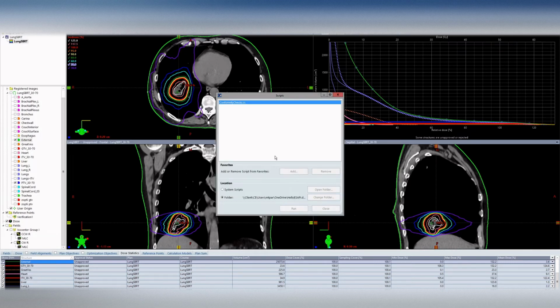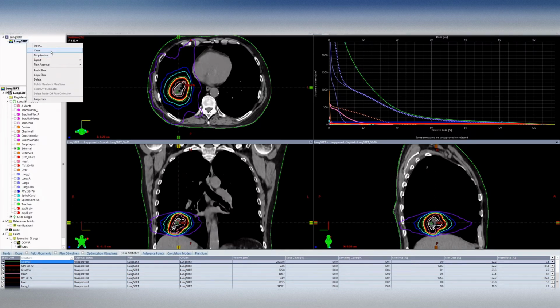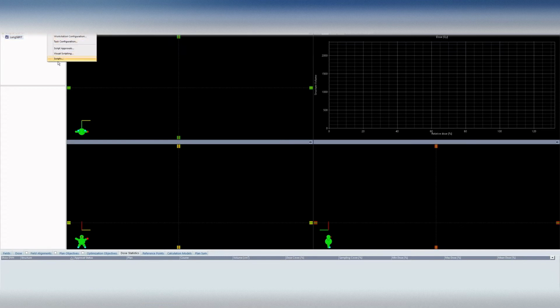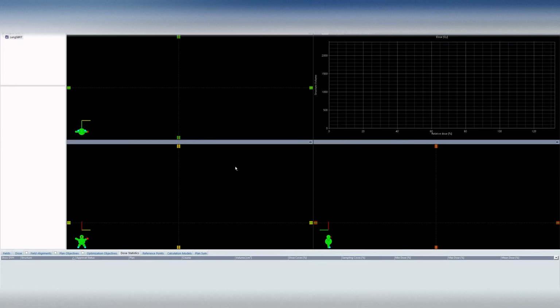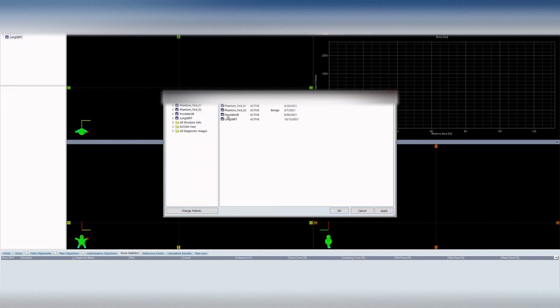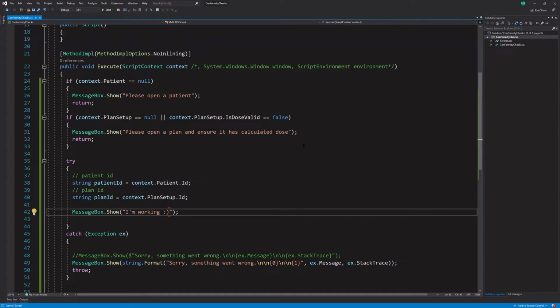So we've opened that, and let's just run it really quickly. So "I'm working." And let's close this plan. We won't close the patient. We won't test that one, but let's just check it. Let's try it again. Okay, so "please open a plan and ensure it has calculated dose." So that's working. We can open this plan again, and we'll open this course. Yeah, that's working. That's good. So now let's go back to this.